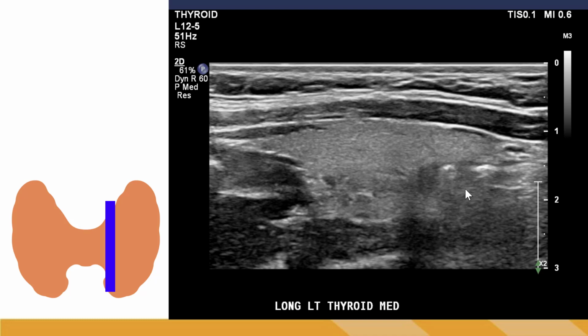As you move towards the trachea, you will actually see these little white echogenic rings. Those are the cartilage rings of the trachea that keep it open. Again, at this point, I would do a sweep through the lateral neck, checking for any abnormalities out there, and then also complete any documentation of pathology seen on the left lobe.